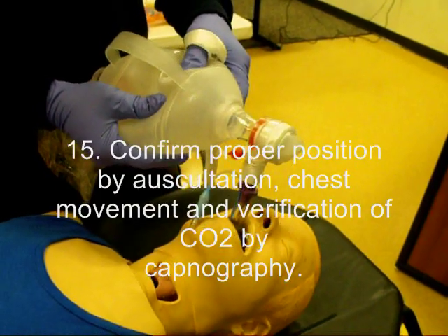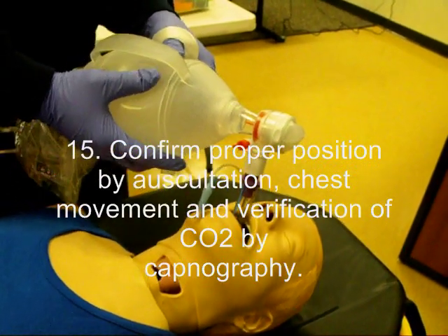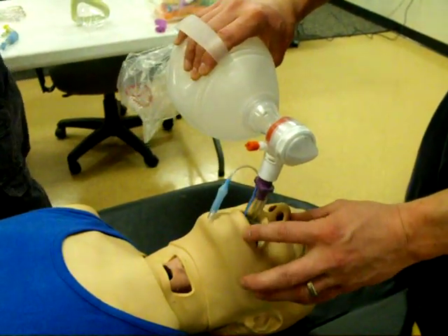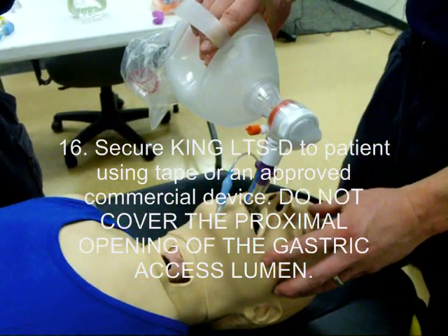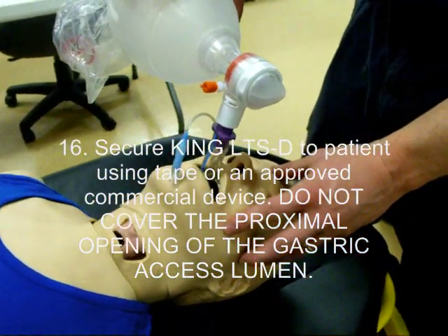Confirm proper positioning by auscultation, chest movement, and verification of CO2 by capnography if available. Secure the airway to the patient using tape or an approved commercial device. Ensure that you do not cover the proximal opening of the gastric access lumen.